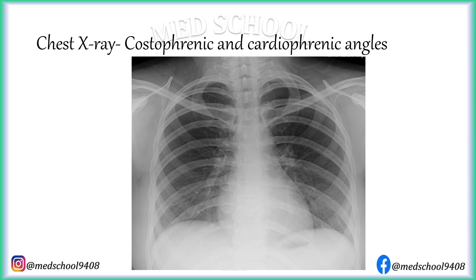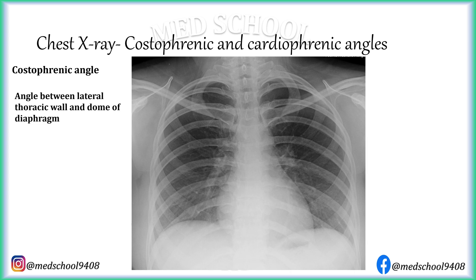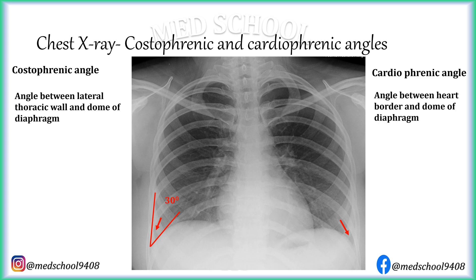The diaphragm forms two important landmarks on chest X-ray. First is the costophrenic angle, which is the angle between the lateral thoracic wall and the dome of the diaphragm — normally 30 degrees. The costophrenic angle is blunted in cases of pleural effusion and widened in cases of emphysema due to flattening of the dome of the diaphragm. The second landmark is the cardiophrenic angle, which is the angle between the heart border and the dome of the diaphragm. The cardiophrenic angle is blunted in moderate to severe pleural effusion and local mass lesions.